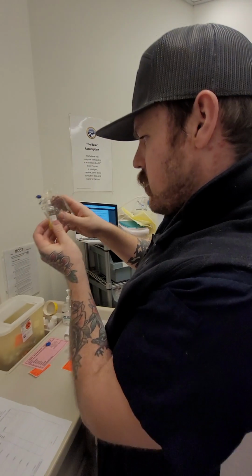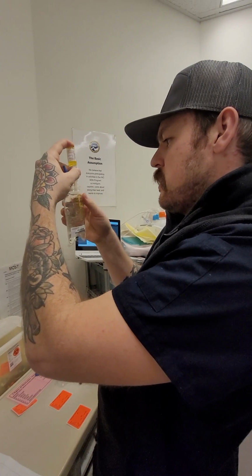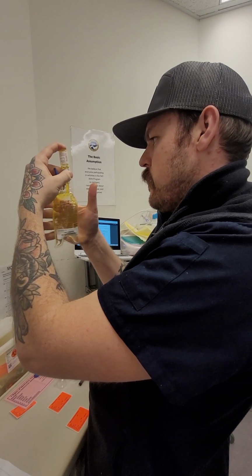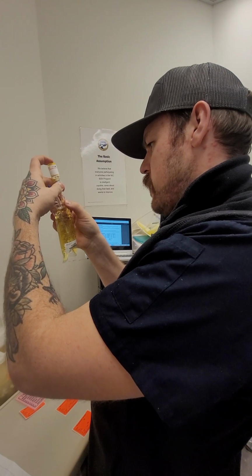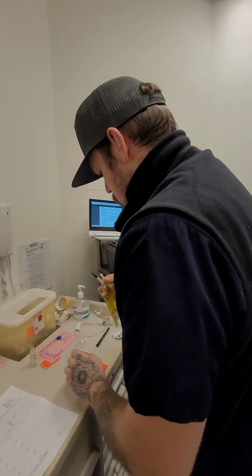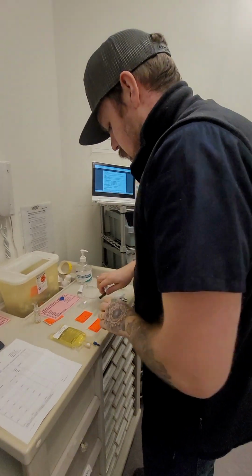Okay, looks to be all constituted here, so I'm going to flip it over and we're going to get that medication out of the vial and into the bag. Perfect. So we've got that just like that. I'm going to leave that right there for now. The sharp's contained. I don't have any worries there. It's just me here. It's perfectly safe. I'm going to set my bag and I'm going to create my medication label.